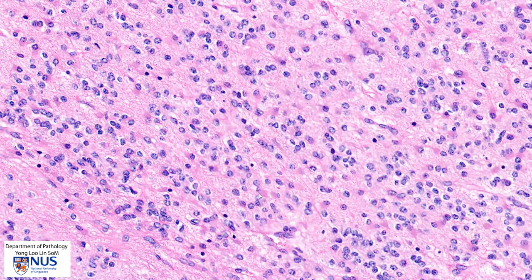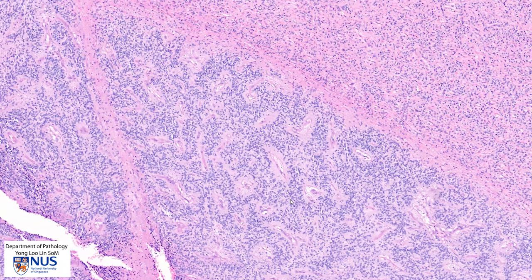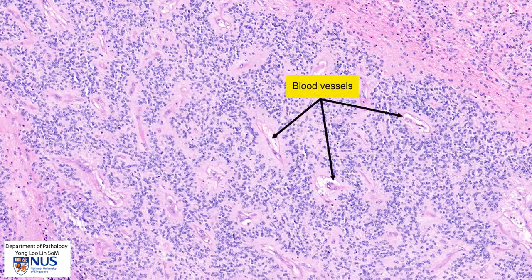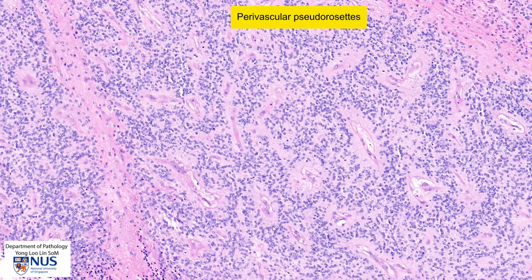Let's now move down to the more interesting bluish area. At this magnification we can see that there are some structures within the center of the paler areas — these are blood vessels — and the tumor cells appear to palisade around the blood vessels, surrounded by this zone of hypocellular fibrillary material. These are known as perivascular pseudorosettes and they are frequently seen in ependymomas.